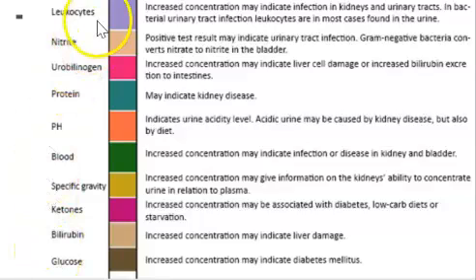On this slide, it's showing you exactly what a urinalysis test strip or a dipstick will look like. Each one of these pads on the dipstick represents a different test. So when you dip this dipstick down into the urine sample, it will be performing a different chemical test on the urinalysis sample. So out here to the side, it's talking about different possible indications of each of the tests, and we talked about some of those indications as we went through each of the tests on the previous two slides.